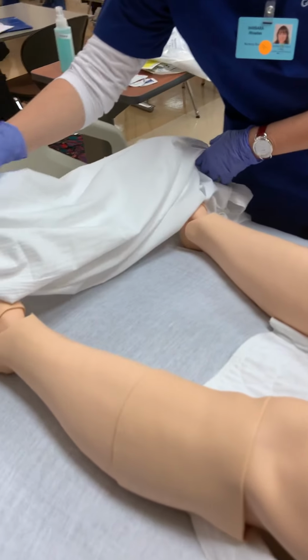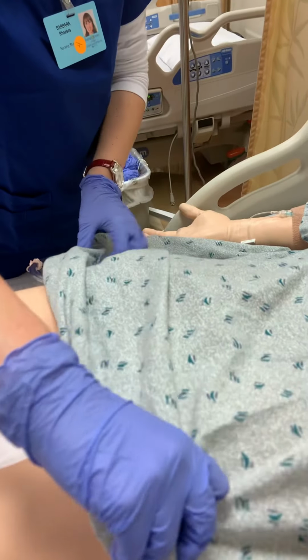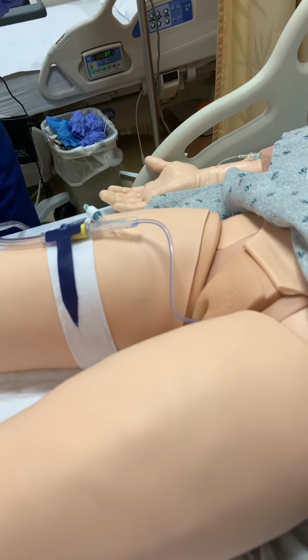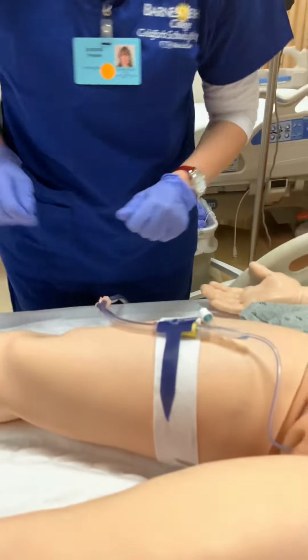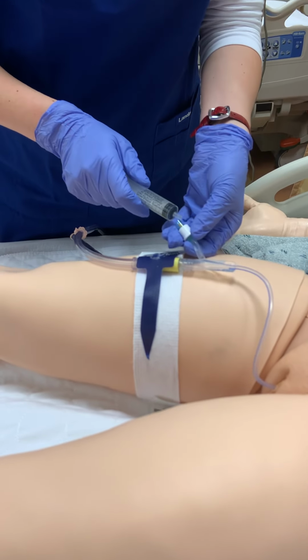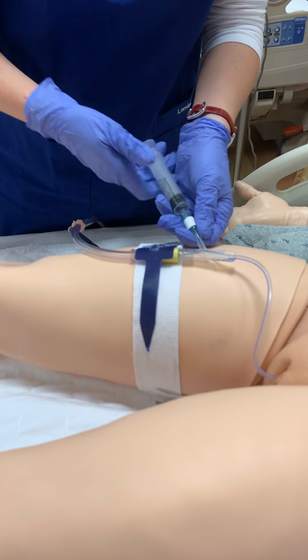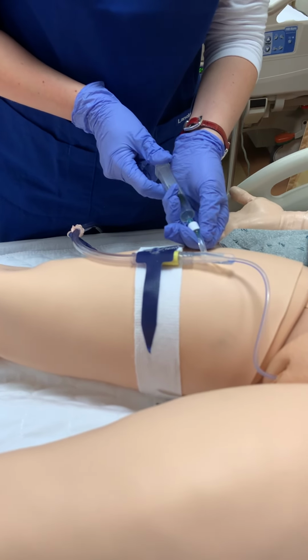Okay, I'm going to just, if you don't mind, lift up your gown. Okay. So I can start with, let me just go ahead and grab the syringe because we need to deflate the line. Yeah, no, I smell it. Oh, I just smell the orange. Maybe I just did a really good job.